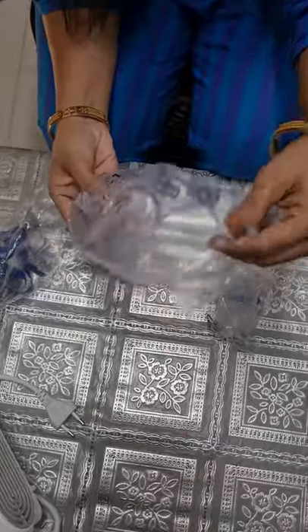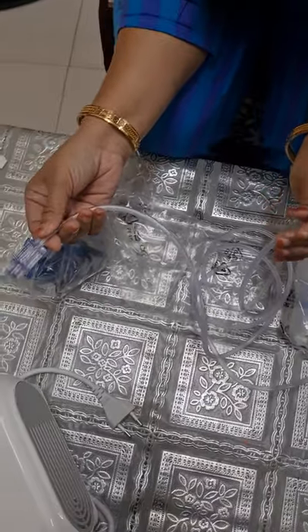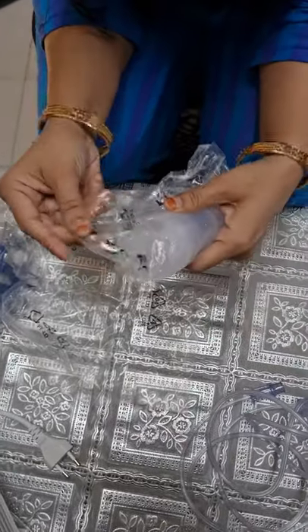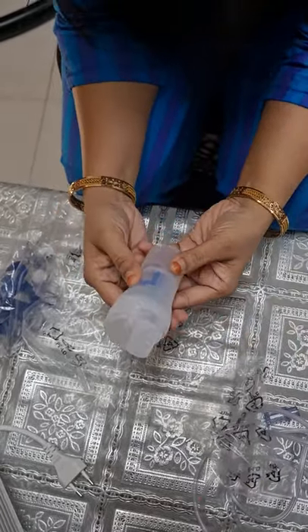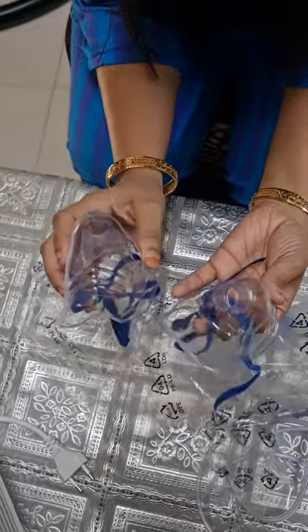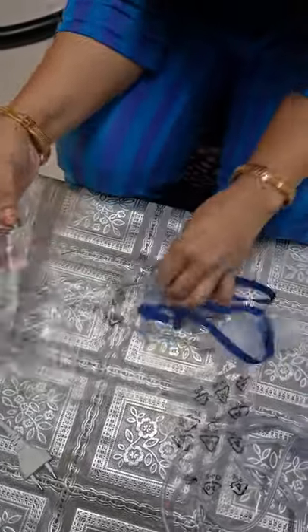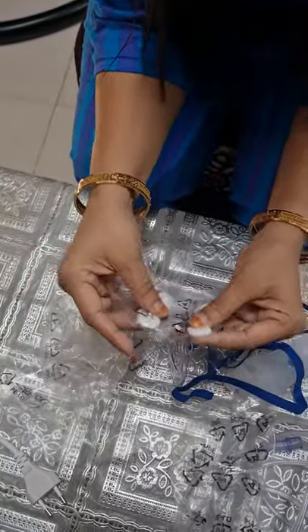Now we'll see the accessories attached to it. This is your air tube. You can see there are two connectors on the sides — one end is connected to your compressor and the other is connected to your nebulizer. This is your medicine device, where you will put the medicine. They have given two types of masks — this is for kids and this is for adults. Along with this you will find a mouthpiece also. And they have given five separate filters.